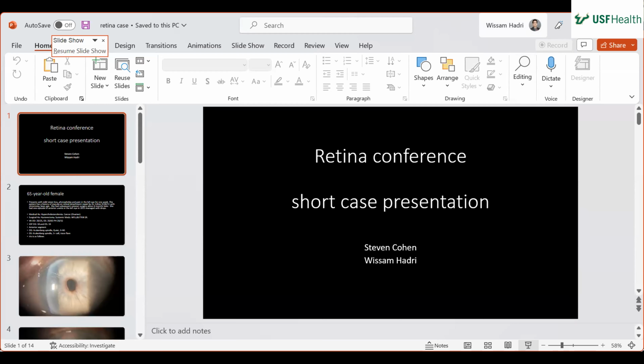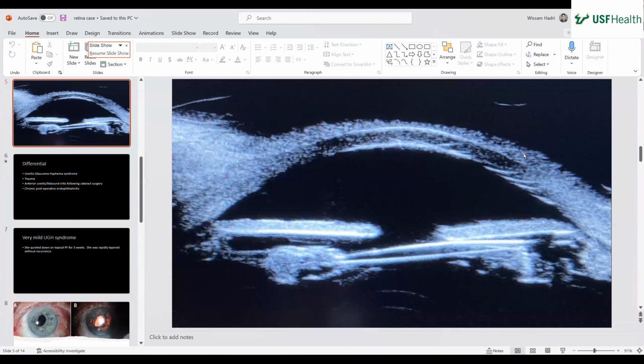And the other thing I can tell you, some of the best surgeons, especially the best young surgeons, do small pupil cases. And that's where I've seen people malposition lenses, because you just can't see it. And then afterwards, you're like, use your hooks. It takes more time, yeah, because you're not used to using hooks. But try to see the bag. This lens is not in the bag on the right.